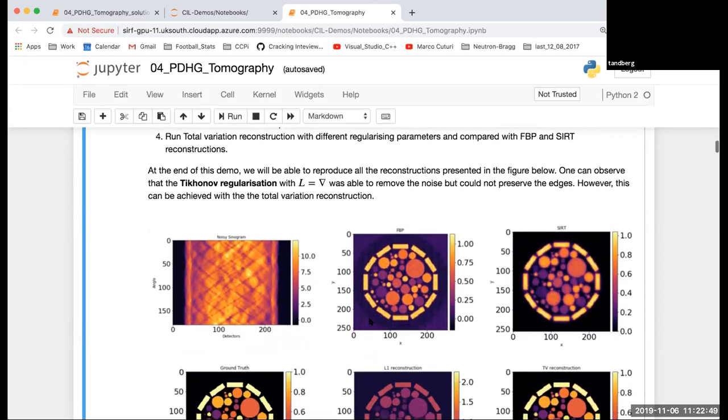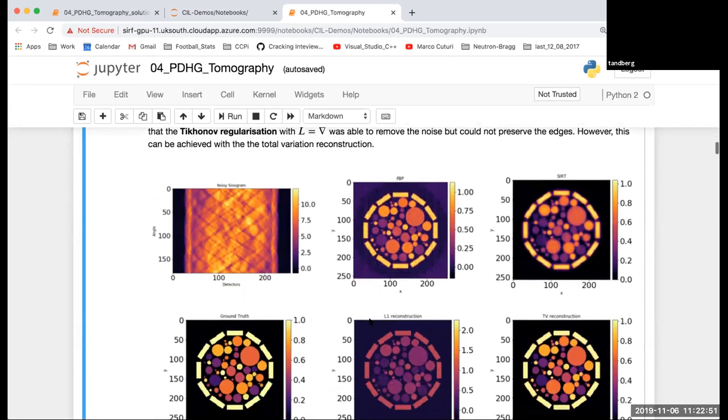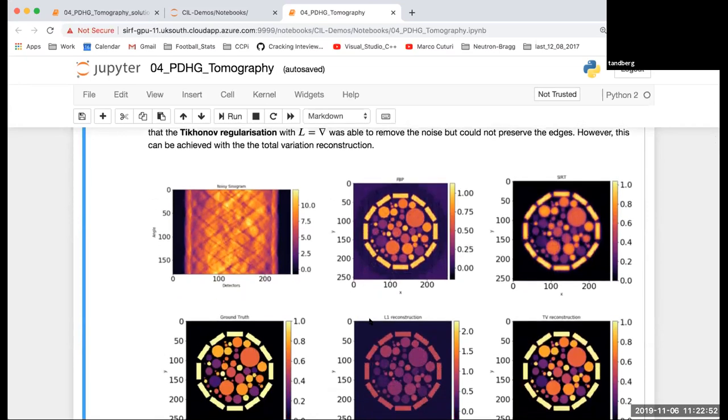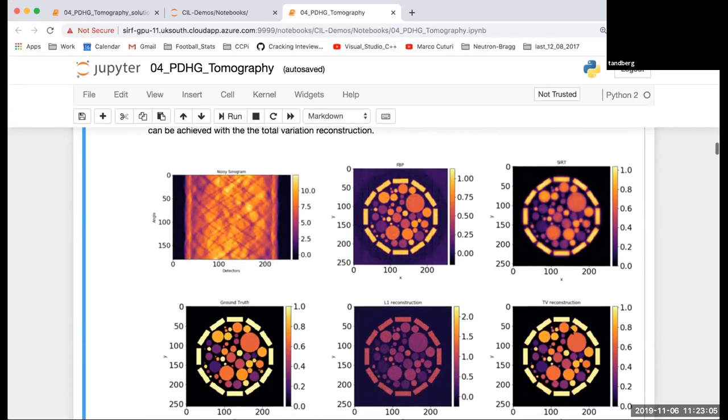At the end you should be able to reproduce all these results. These are the noisy sinogram and the ground truth, and you can do a filter back projection, SIRT, the L1 reconstruction, and total variation reconstruction.